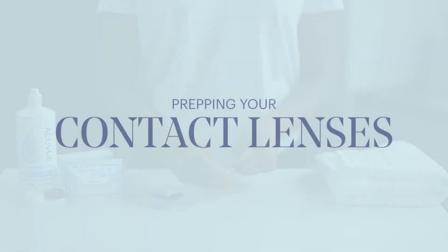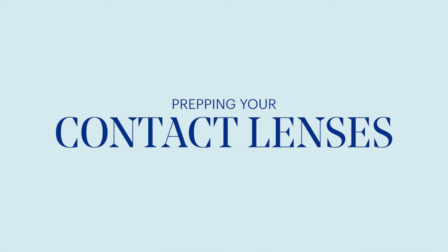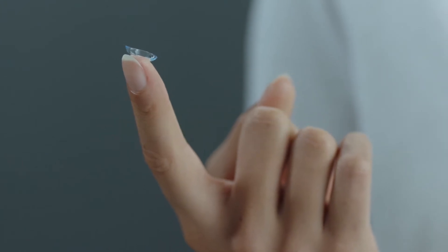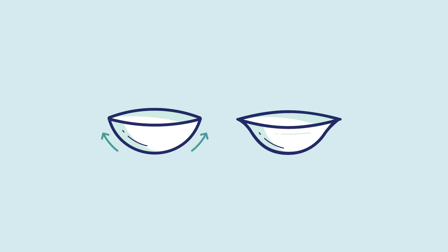Once your contact lens is ready for application, scoop it with your fingertip and slide it up the side of the bowl. Take a closer look: if it's shaped like a little bowl with a nice straight edge, it's in the right position. If the edge curves outward, it's inside out. But don't worry — if it's inside out, just flip it.